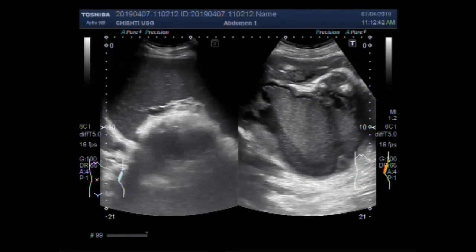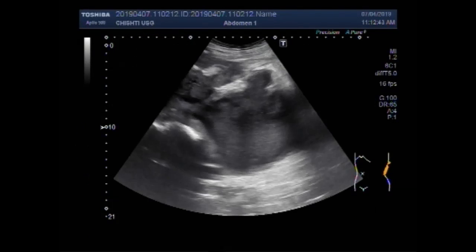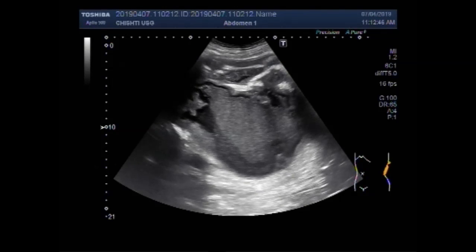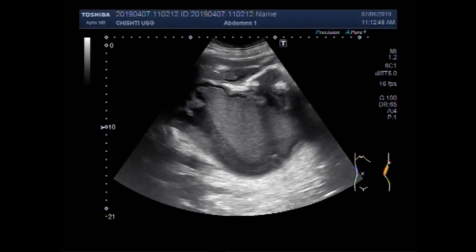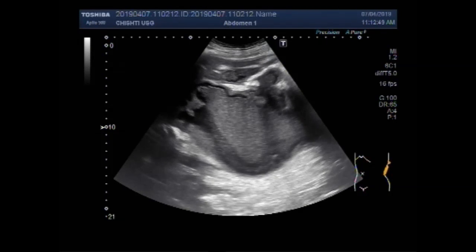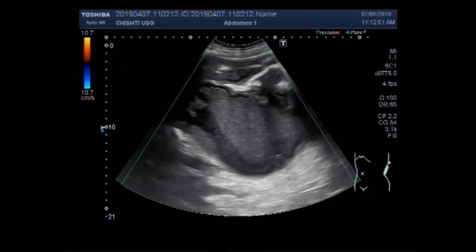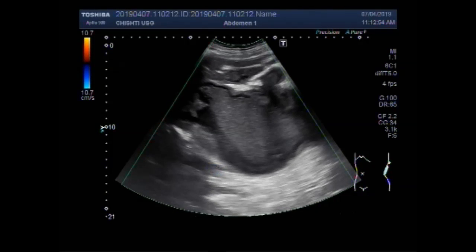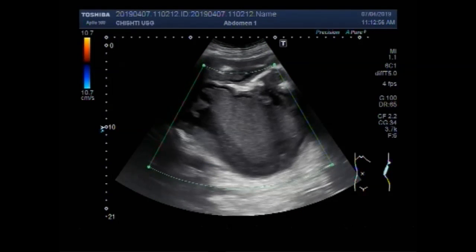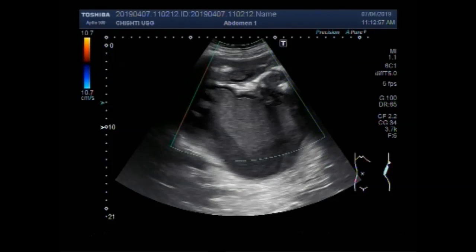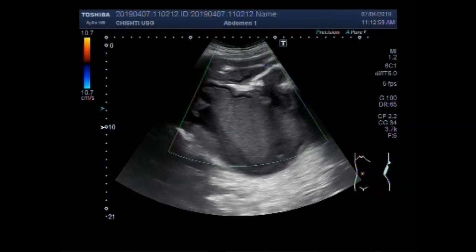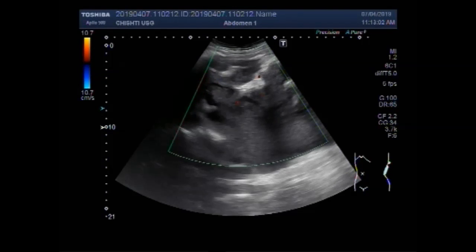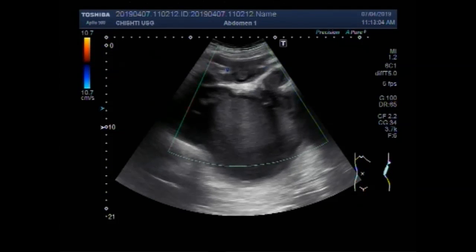This is the renal mass. With the patient in the side-on position, you can see the left kidney is invisible and quite a large mass is seen.